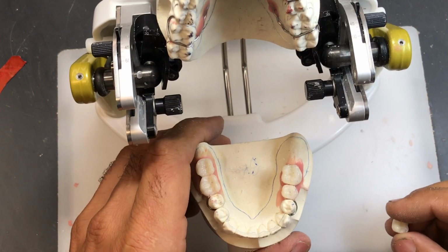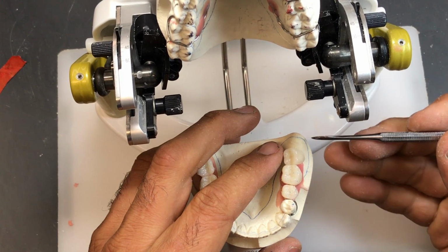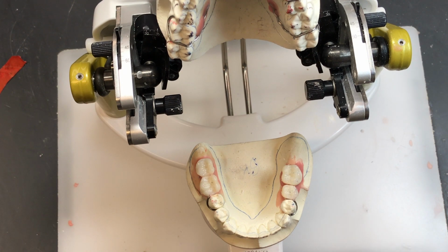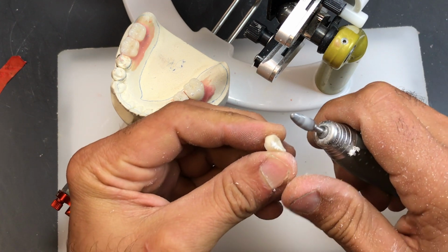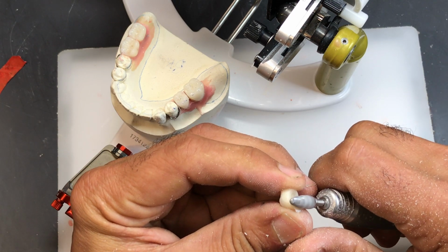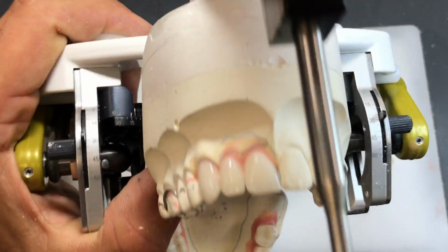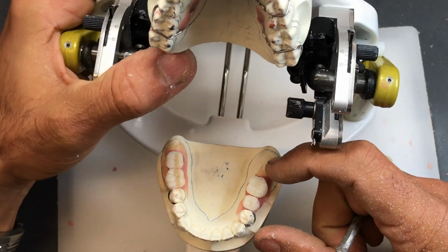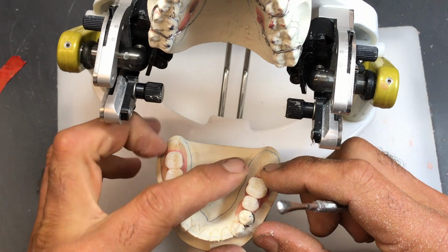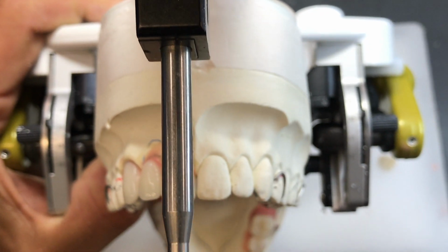And again, I'm going to use the tooth before just to give me an idea where I'm going with this. And it feels like there's going to be some interference at the distal buccal aspect of the tooth. So I'm going to put on my tapered burr. And I have lots of tooth surface here to work with, so I'm not concerned about over grinding the tooth. So the distal buccal aspect, I'm just going to shave some off from the ridge lap portion of the tooth to prevent the interference. And then once more, it looks like I created a little diastema between here. So this tooth might have moved over. Maybe my wax was not hard enough. So make sure you close that up. Okay, I'll close that up and maybe spot grind if I have to again.